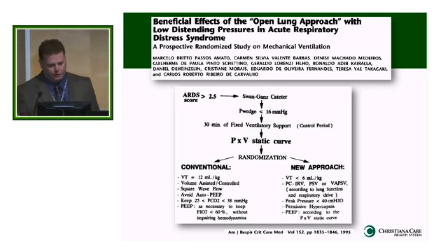They used pressure control, a lot of it PCIRV, inverse ratio pressure control. But it was all pressure ventilation, and they kept the PIPs low. They did recruitment maneuvers. They did P-flex points on the patient to figure out where to set the PEEP, and they set the PEEP above the lower P-flex. So they basically combined a lot of that stuff we talked about all together in one.